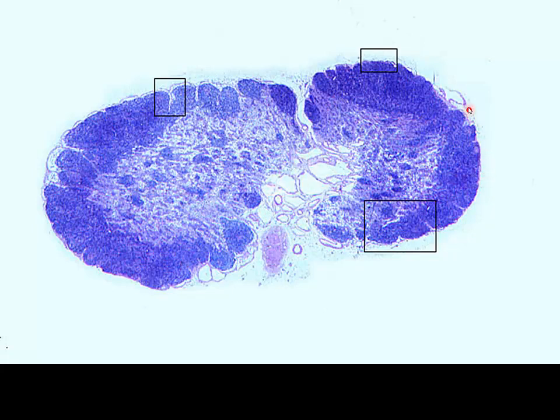We're going to have our capsule on the outside, and we actually can see some of our subcapsular sinuses, that subcapsular space there. And within some of these, we're going to see other lymphatic vessels, and this would be the location of our afferent lymphatic vessels. The darker region where we're going to see our lymph nodules is the cortex, and the lighter region is going to be our medulla, where we have our medullary sinuses and our medullary cords.